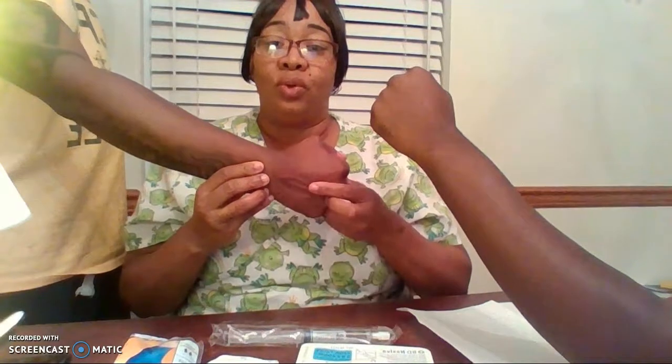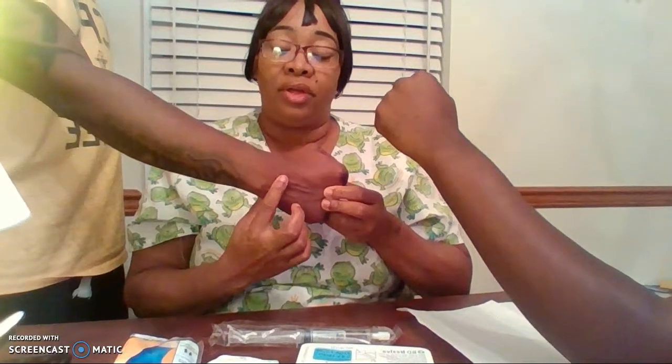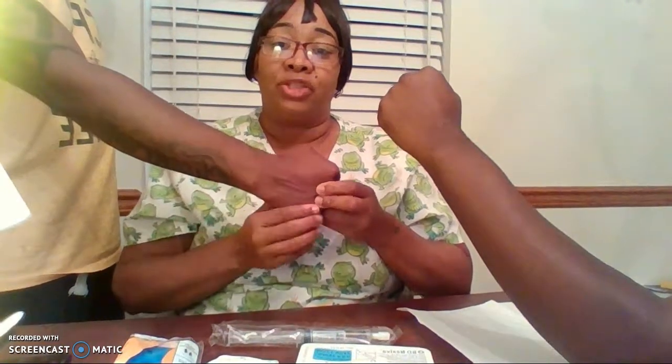If you select a vein that's in the hand, sometimes you can see the veins, but as you can see with this one, they are very mobile, and so you're going to have to use your fingers to stabilize that vein when you are trying to access it. It's close to another vein, so you've got to pick the one that has the least amount of resistance and also the least amount of valves and such.